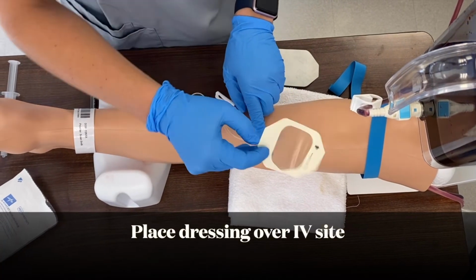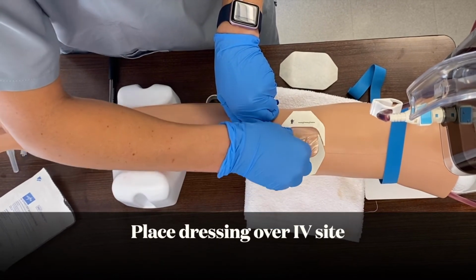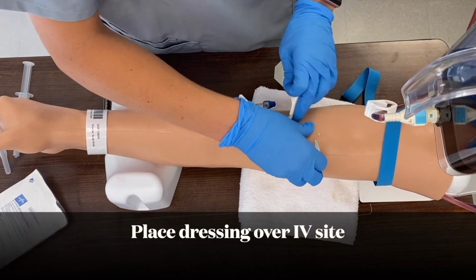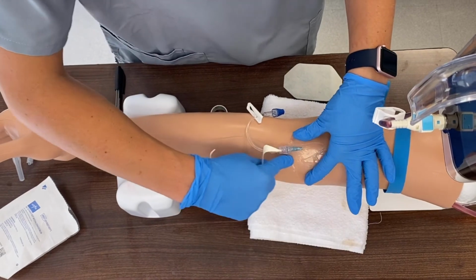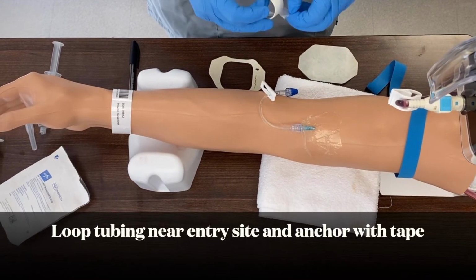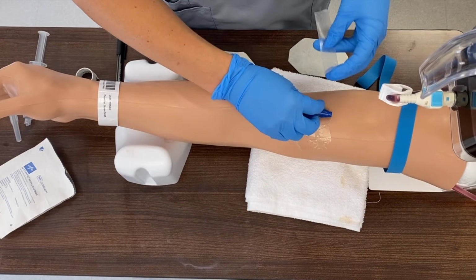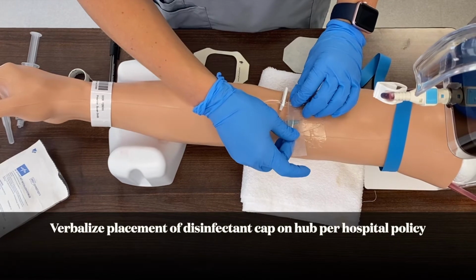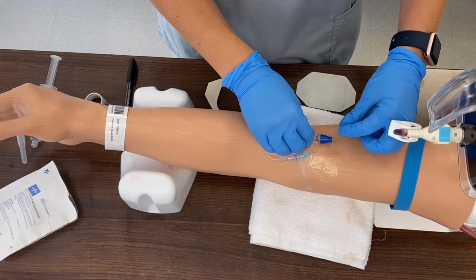Place sterile, transparent dressing over venipuncture site, including only the catheter hub. Loop the tubing near the entry site and anchor with tape. Anchor with additional tape if needed. Verbalize placing disinfecting cap on hub per hospital policy. If this hospital policy was to put a sterile cap on the hub, I would do that at this time.